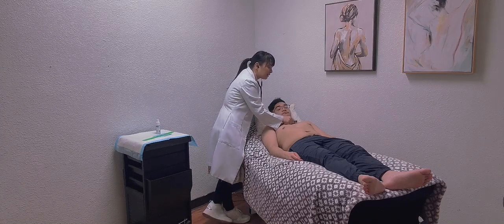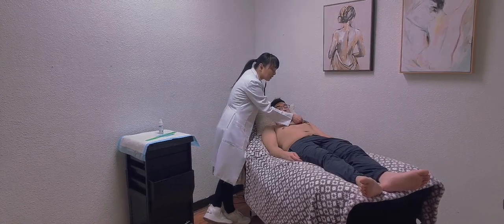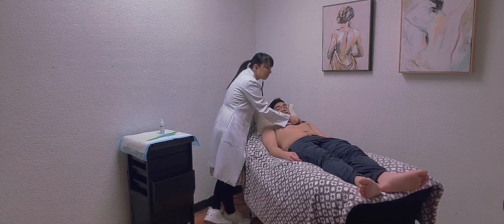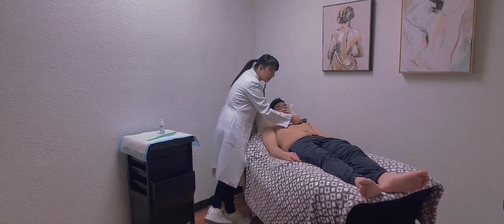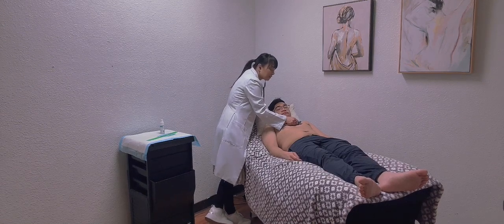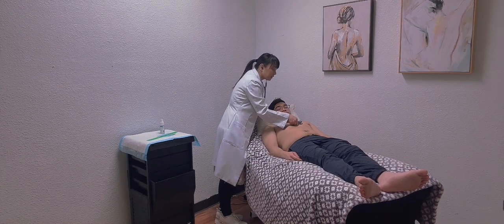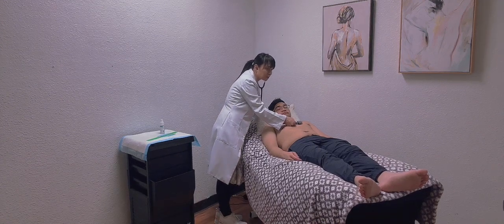Now moving to Erb's point, located at the 3rd intercostal space on the left sternal border, using the diaphragm and bell of my stethoscope. I'm listening for any thrills, murmurs, clicks, or gallops. I don't hear any abnormalities — all normal findings. Now moving to the tricuspid area at the 4th intercostal space on the left sternal border, again using the diaphragm and bell. I'm checking for any murmurs, clicks, and gallops — there are none.